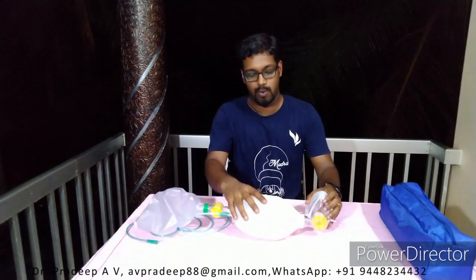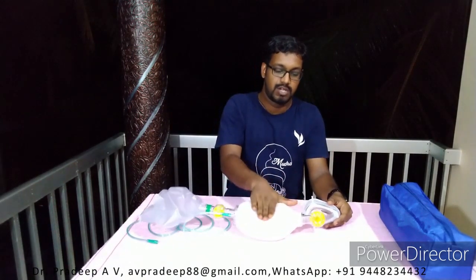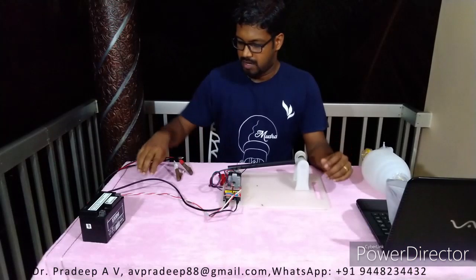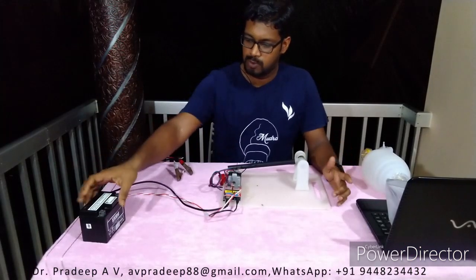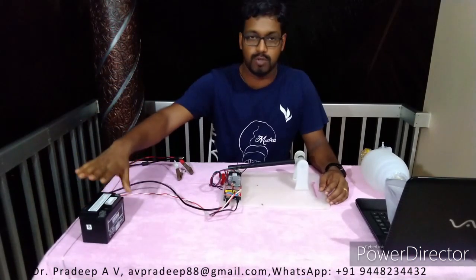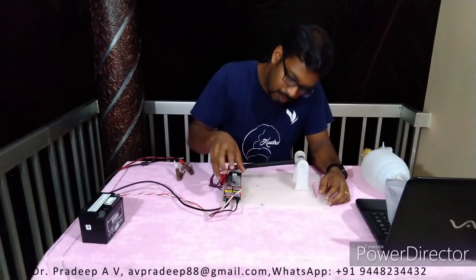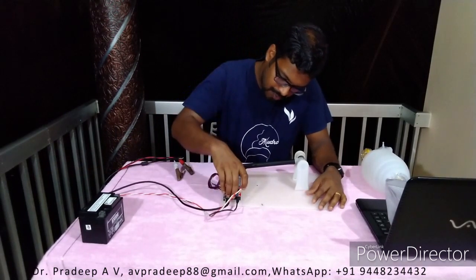Now I'm going to automate it. So the basic design is there will be a shaft, which is going to press it automatically. Here is my setup. I use a 12 volt battery, which is generally used for bikes and scooters, and then I use an Arduino UNO, which is kept here. So if you want, I can show it.